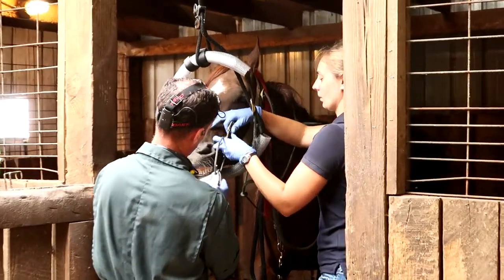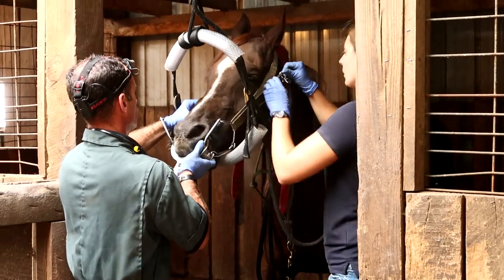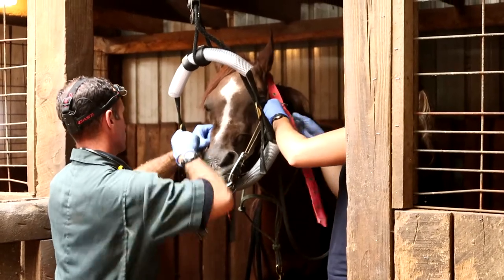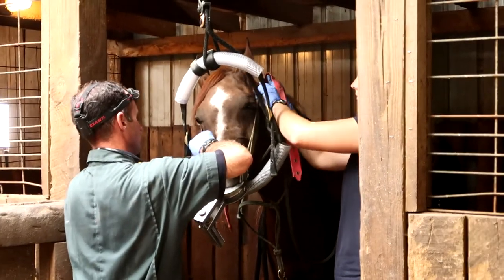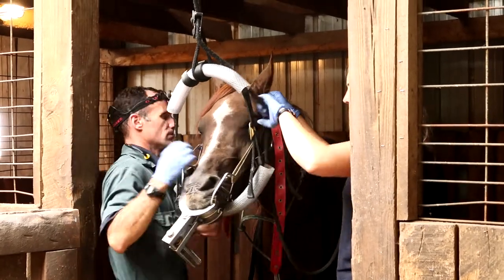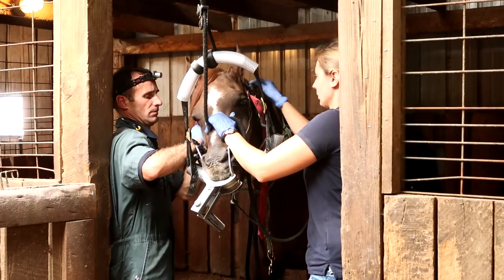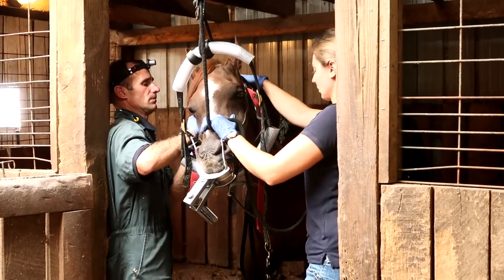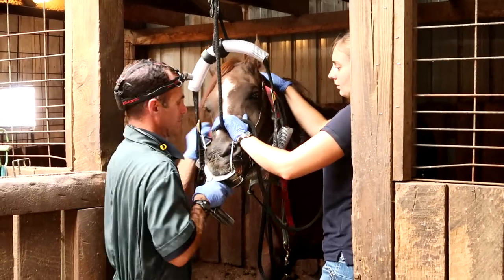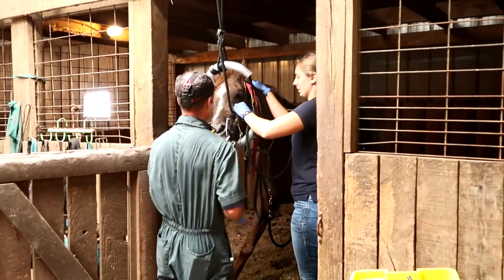The little piece of equipment that Dr. Scott is putting in Tino's mouth here is called a speculum. Basically, it's a device that allows him to have a place to rest his front teeth and it keeps his mouth open, so Dr. Scott can look or feel around his mouth without having to worry about getting bit or Tino chomping down on him. It's kind of the same thing as when you go to the dentist and they put that block in your mouth so that it stays open.